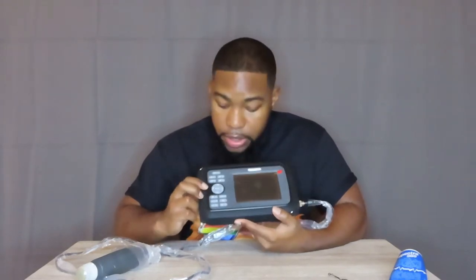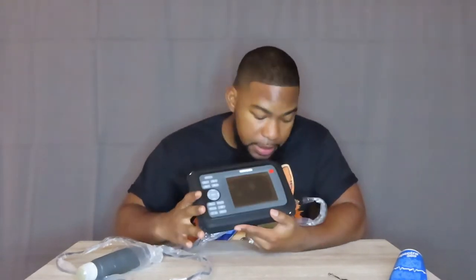So I'm gonna go ahead and cut it on. I wanna let you know that all of these buttons on this machine are multi-use buttons. Every button on here is used for two or three different things. So you have to read the manual. It can get very, very confusing. The simplest button is the on button, which is along the side.